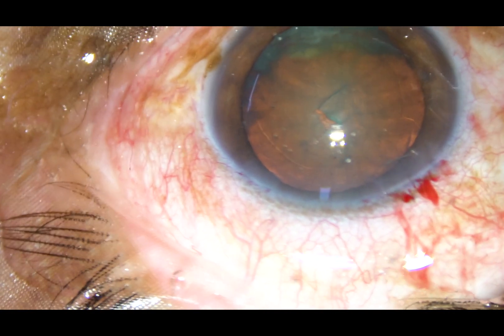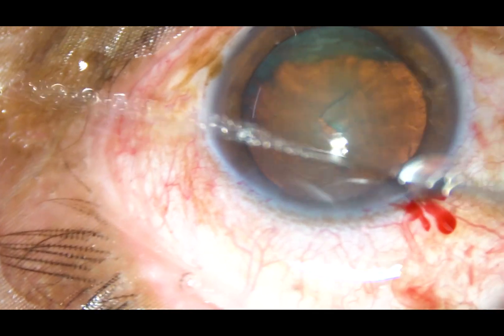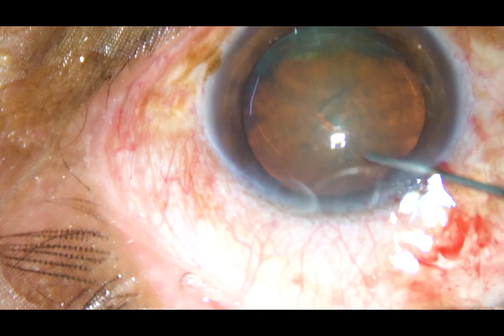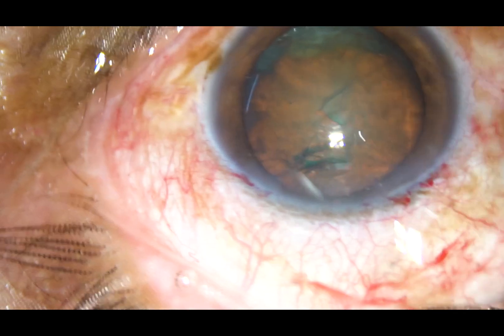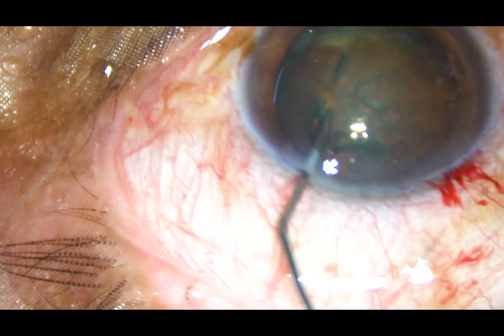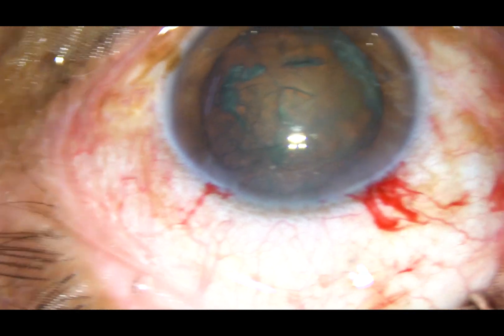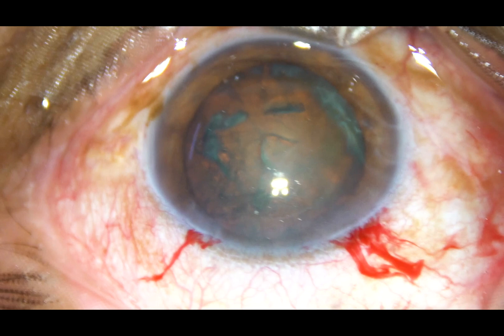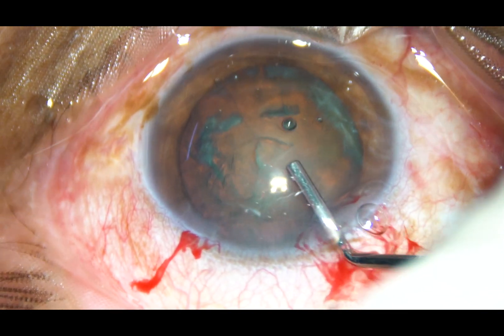Now hydrodissection fluid is passed just underneath the anterior capsular rim. The needle is advanced a little towards the equator and then fluid is injected. The nucleus is tapped and mobilized. You can see that the nucleus moves freely. Hydrodissection is done.